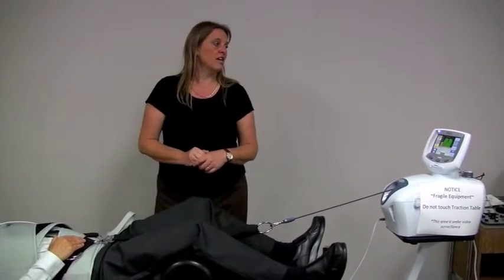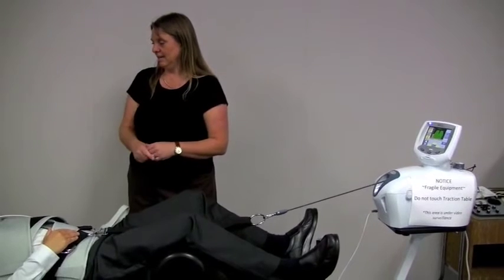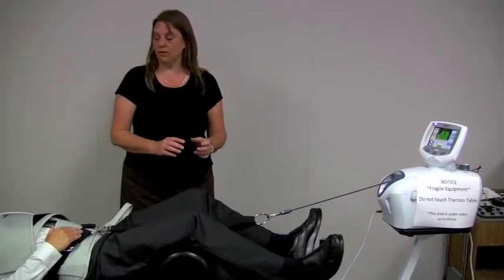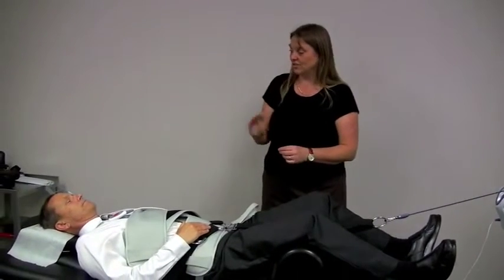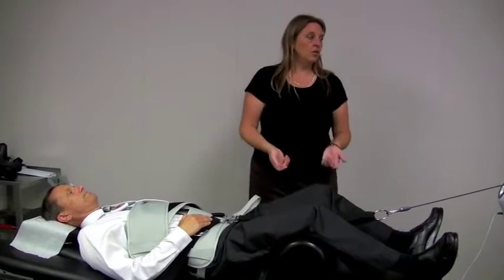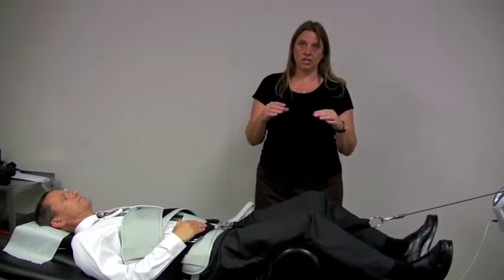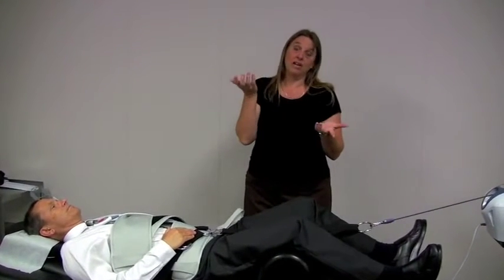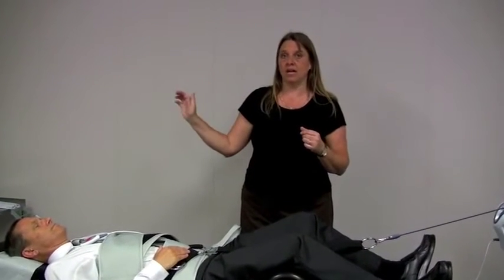All right, we're on regression right now, so you're at 30 pounds. Have you noticed it coming off? Yeah. I did slow down the rope speed, so you didn't notice as much of a difference. So it doesn't change so much so quickly. With acute or tolerance tests, you always do a static progression. You can try intermittent's recommended, an intermittent traction, and then a static regression.